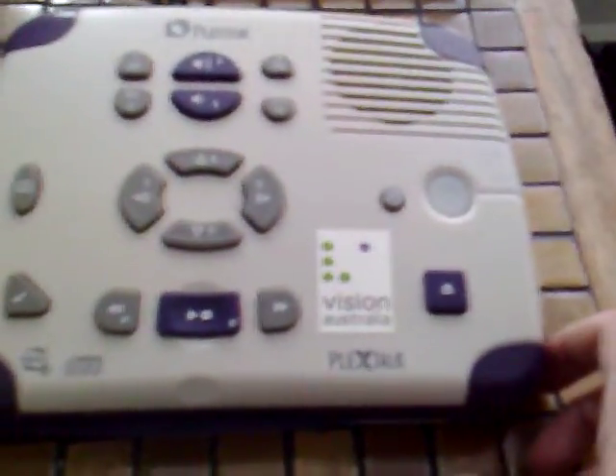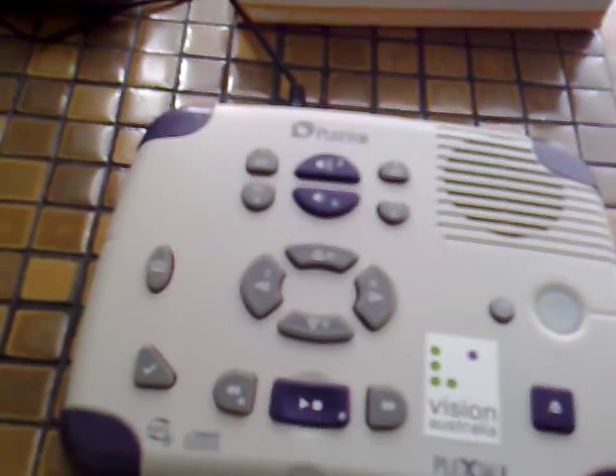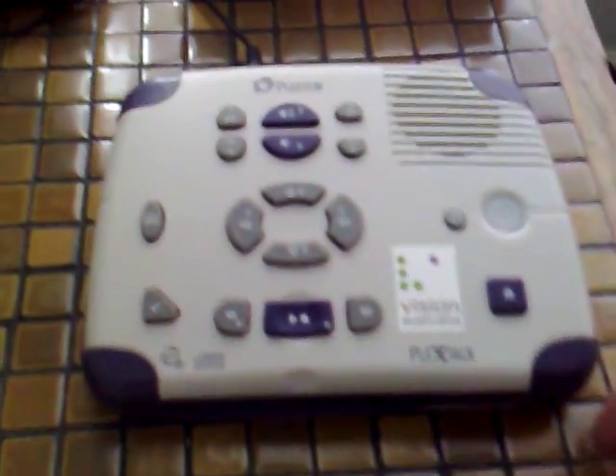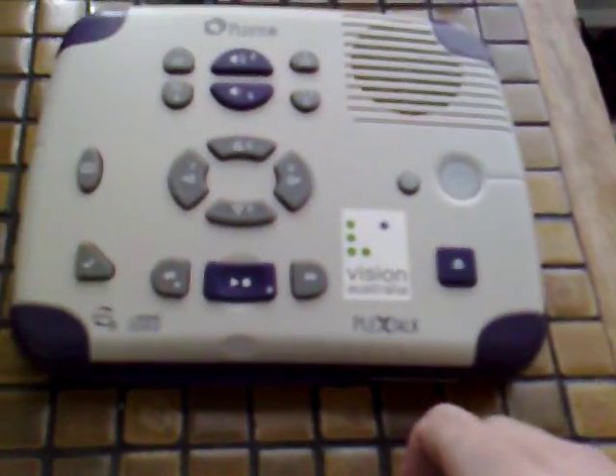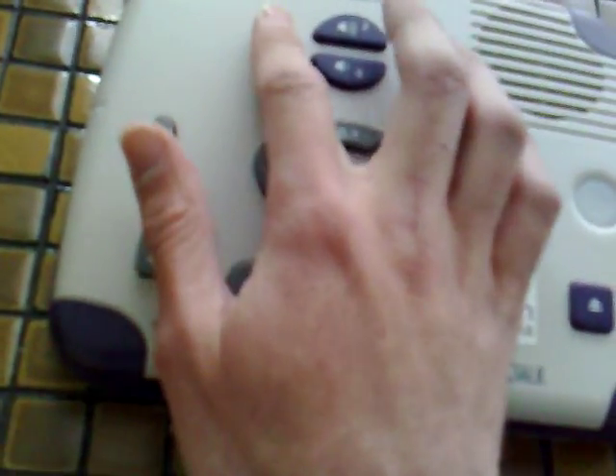First of all, I'll describe the unit. This is a CD machine. Some of the very new DAISY players play books on SD cards. The books can be stored on anything from compact discs to hard discs to memory cards to USB flash devices. At the very top of the machine, you've got tone, volume, and playback speed controls. The ones in the centre are for volume, these ones are just bass and treble, and these ones are just the speed.